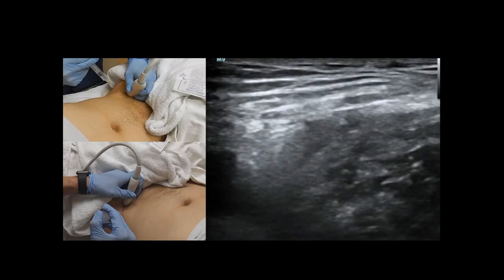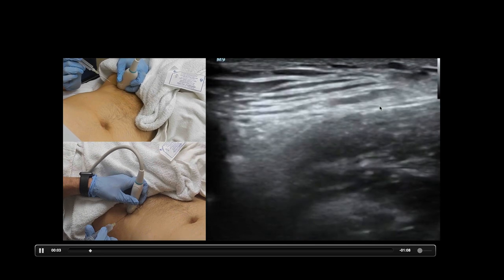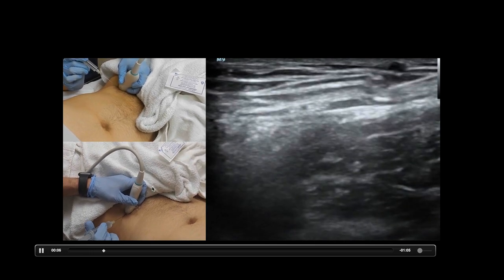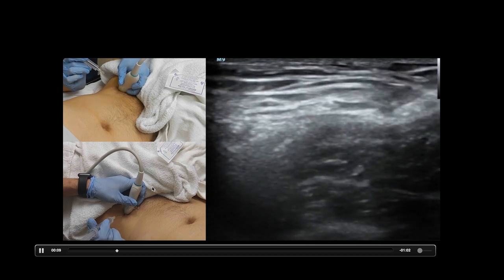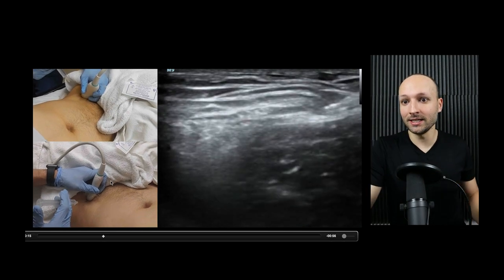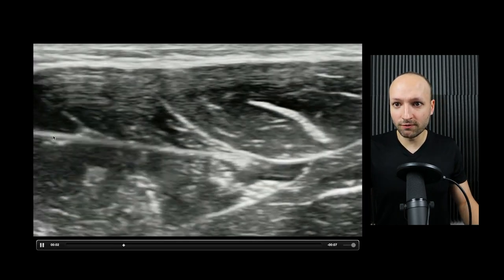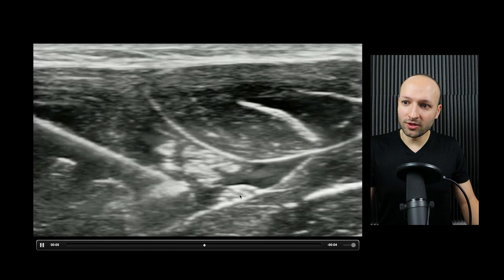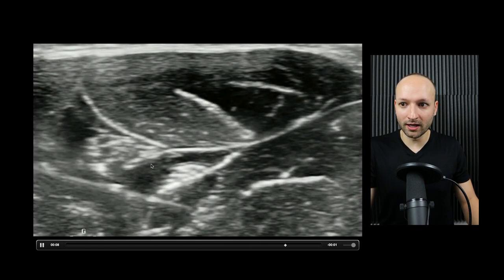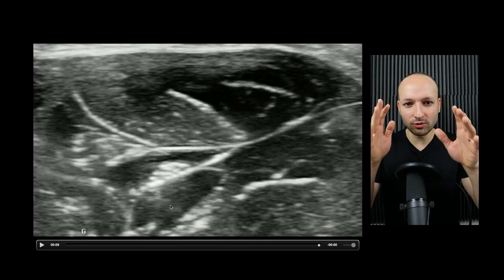As far as your approach to nerve blocks, you can do an in-plane technique or an out-of-plane technique. Here's an example of an in-plane technique for a femoral nerve block — the needle and the transducer are in line with each other. That is the long axis technique. Here's an ulnar nerve block, one of my favorite blocks. You can see really good visualization of the needle tip, the nerve, and the anesthetic going all the way around it. I like the long axis so much better because you get a great view and really good control.